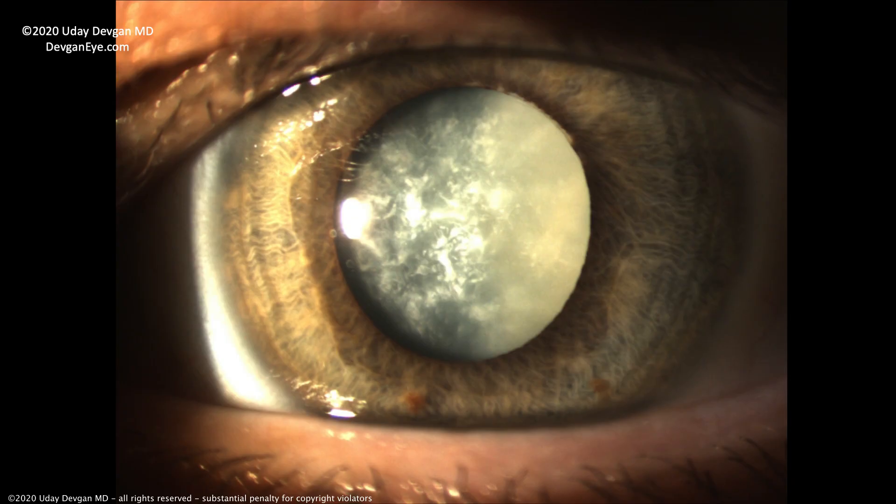Looking here, this is an eye with a cataract. In that central pupil zone, it's very hazy or opaque or whitish — that's a cataract. A cataract means that the human lens has gone from clear to cloudy. A cataract is not a film that grows in the eye, and it does not have to be ripe like a banana for surgery. The best indication for surgery is if your vision is not good enough for your normal daily activities.